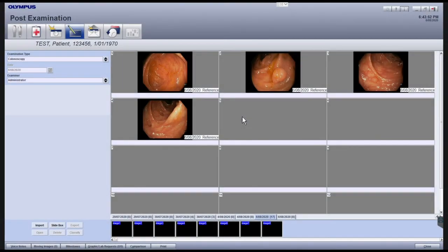After you've selected the images you'd like to include in your report, you can indicate where they were captured with reference to the patient's anatomy by using the anatomical graphics function. To add anatomical graphics, click the Graphic Lab Request button on the bottom of the screen.